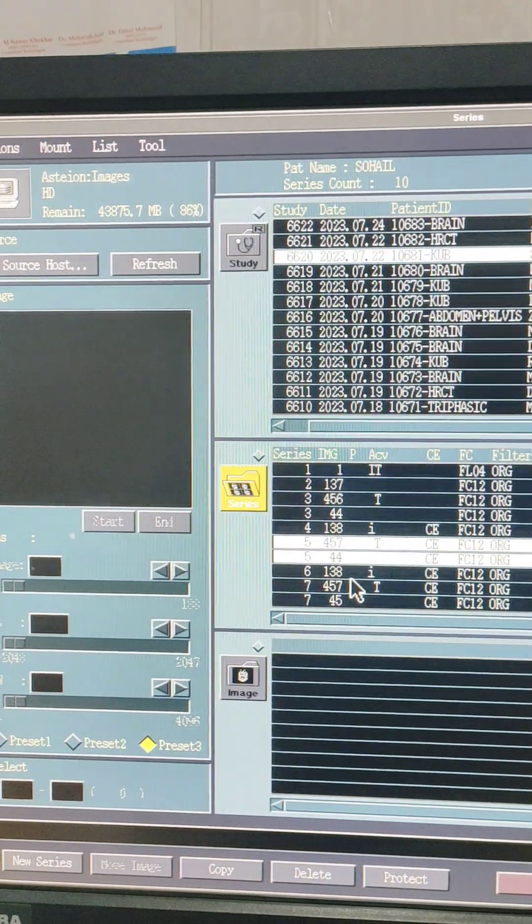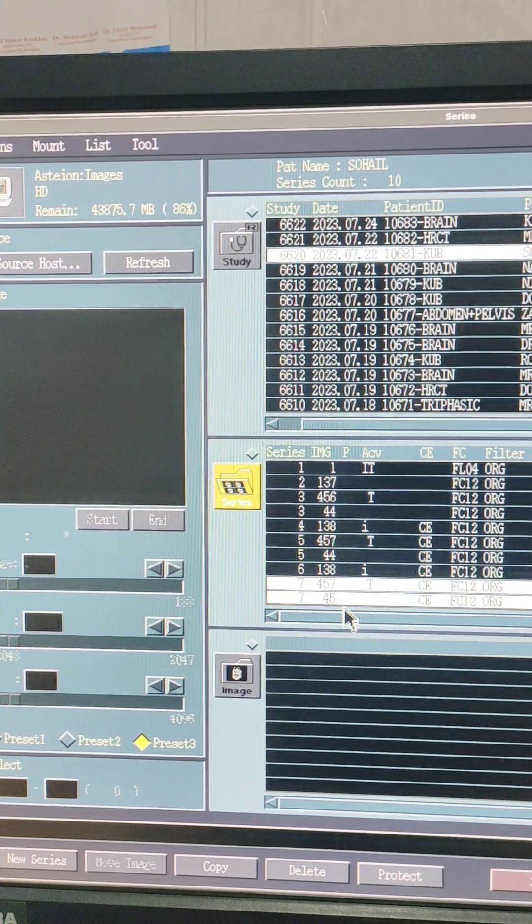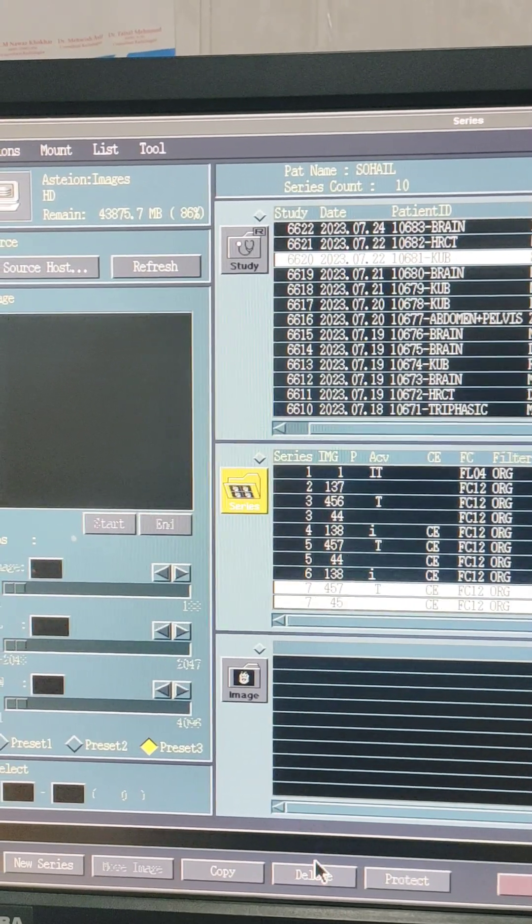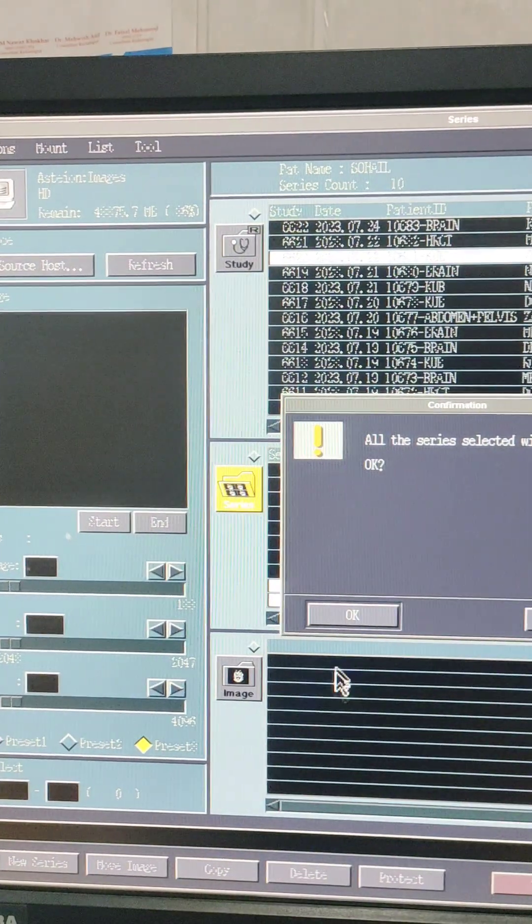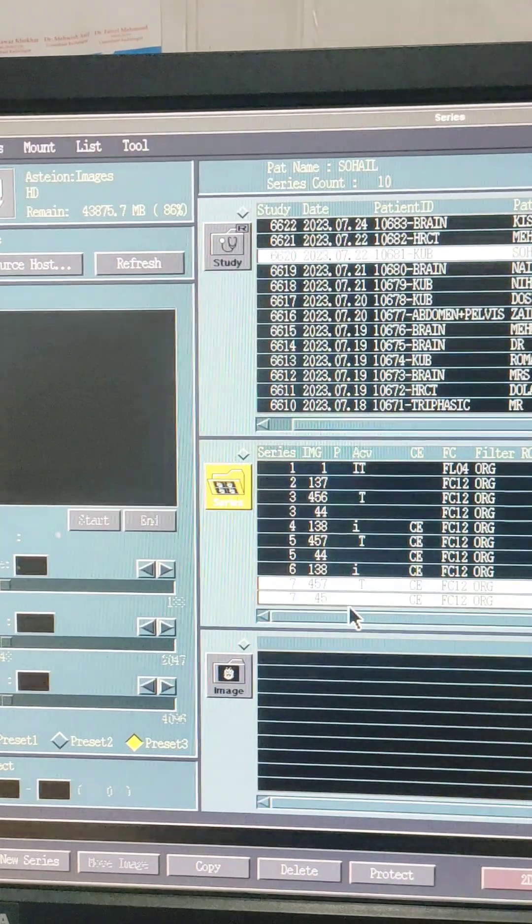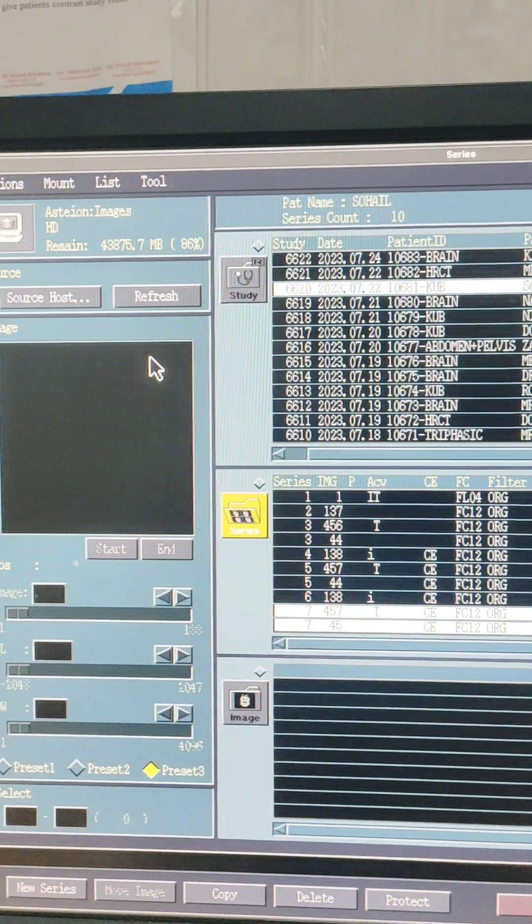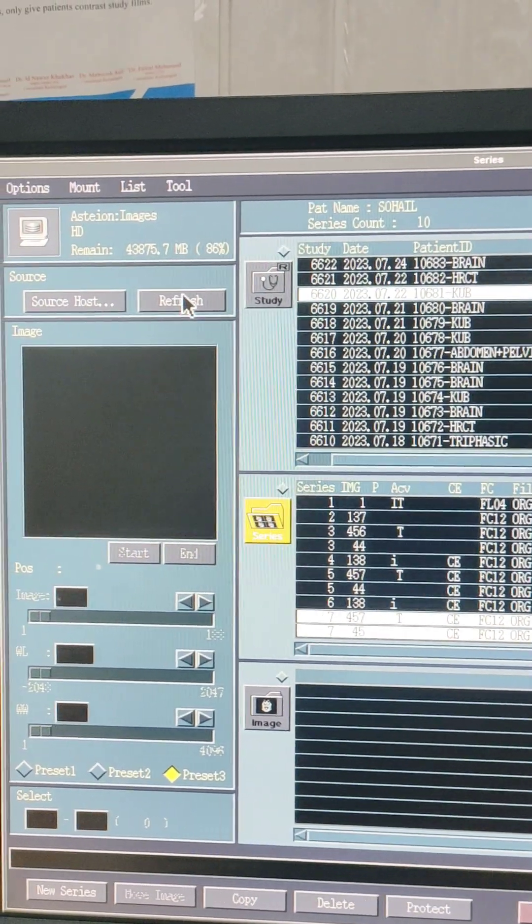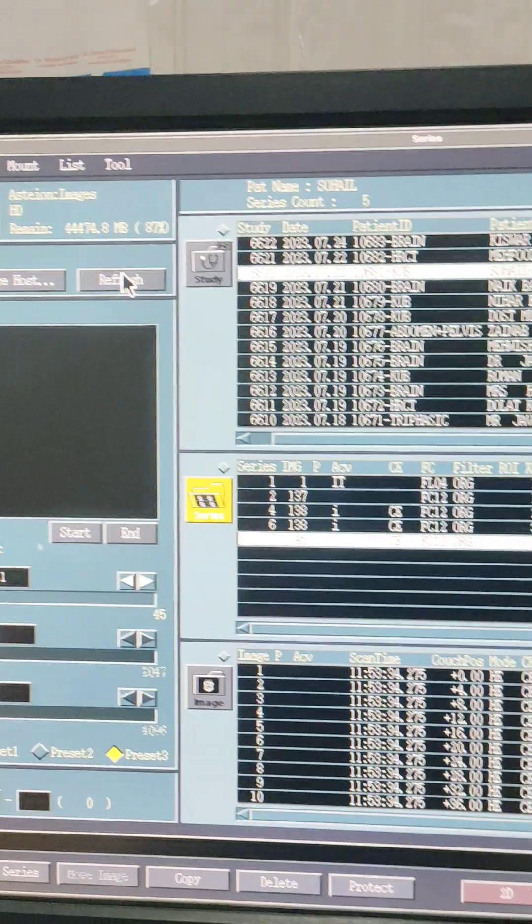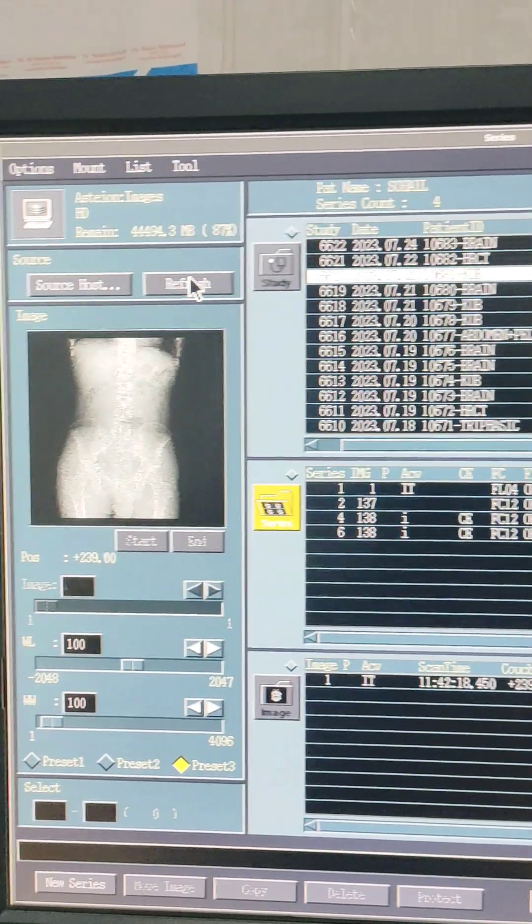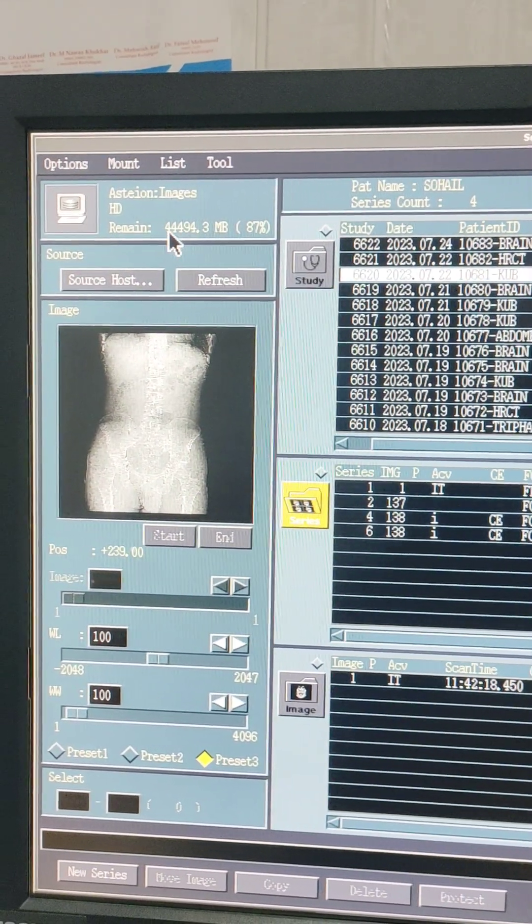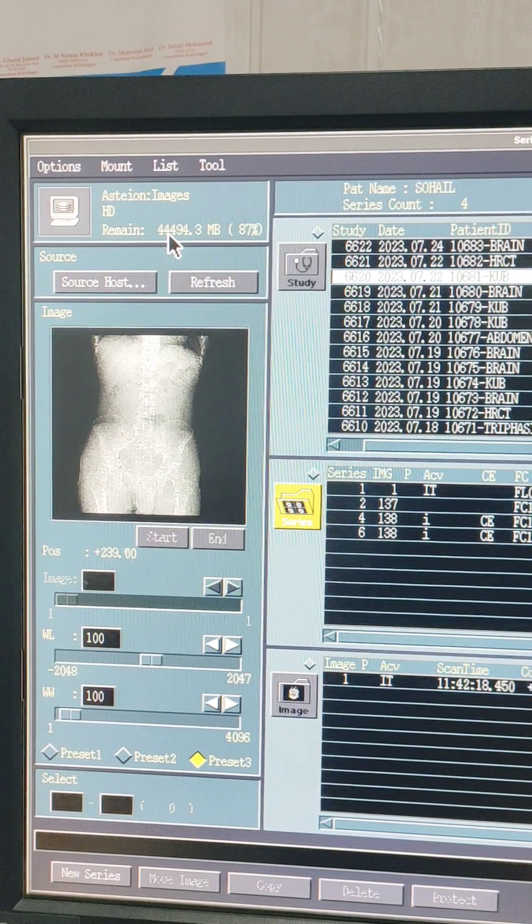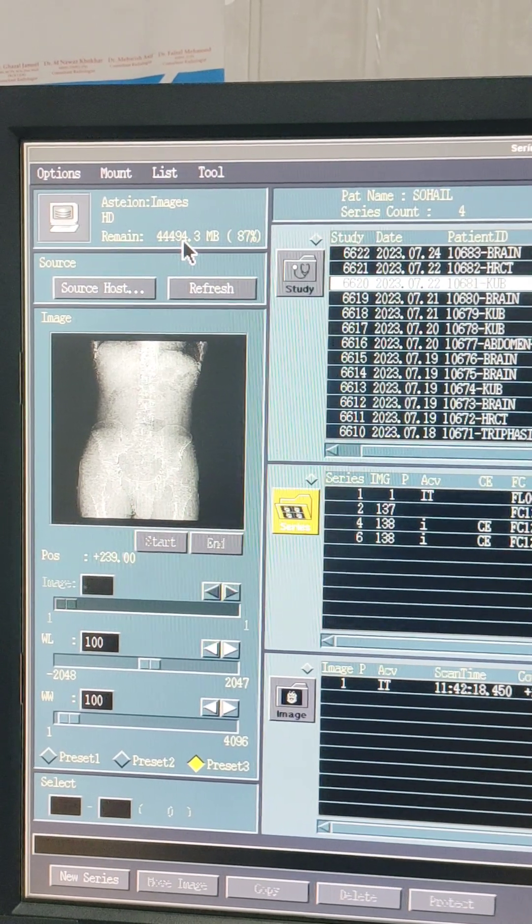And the next one is also delete. OK, go to the refresh. Now check - 44,495 MB.